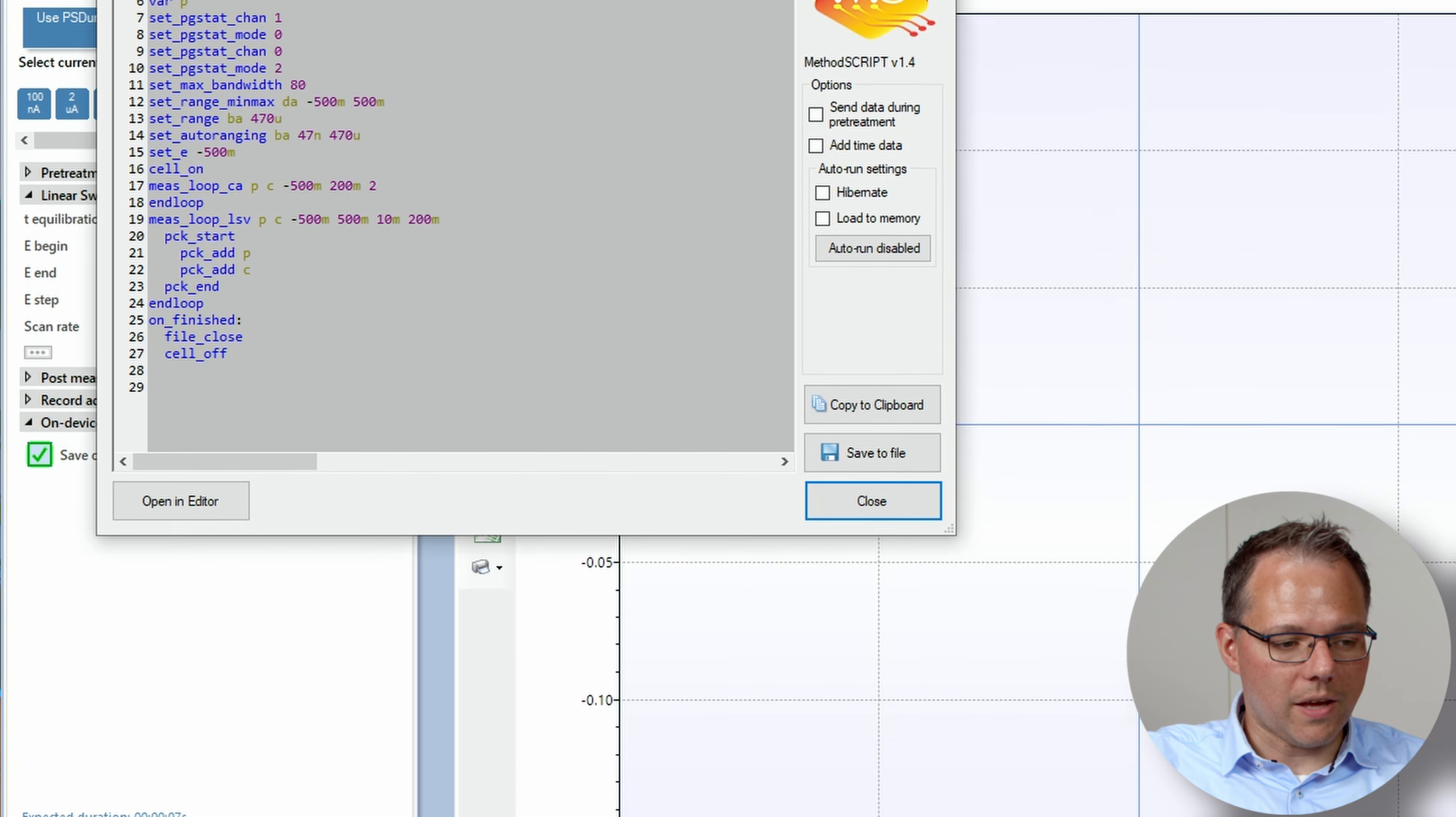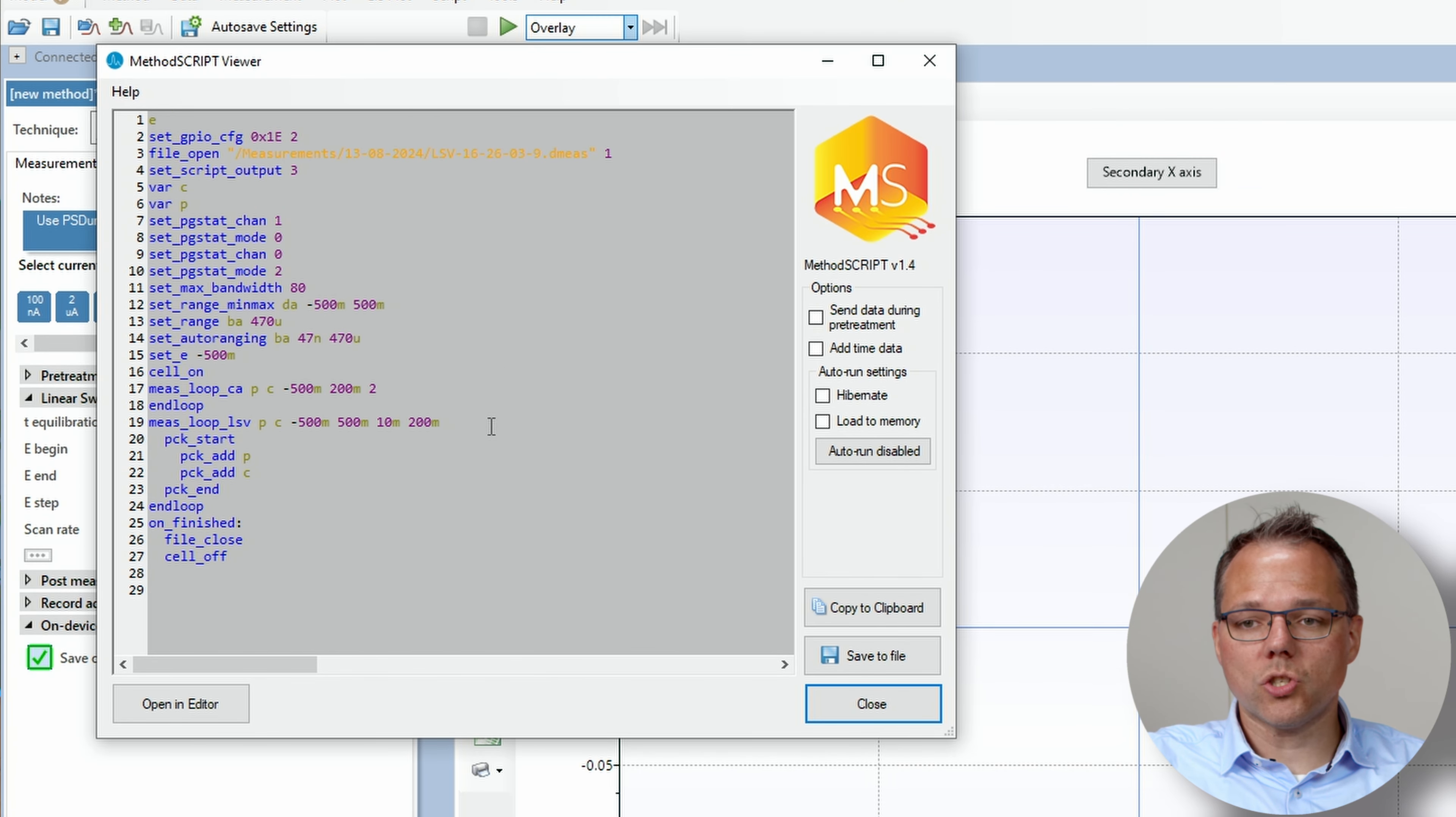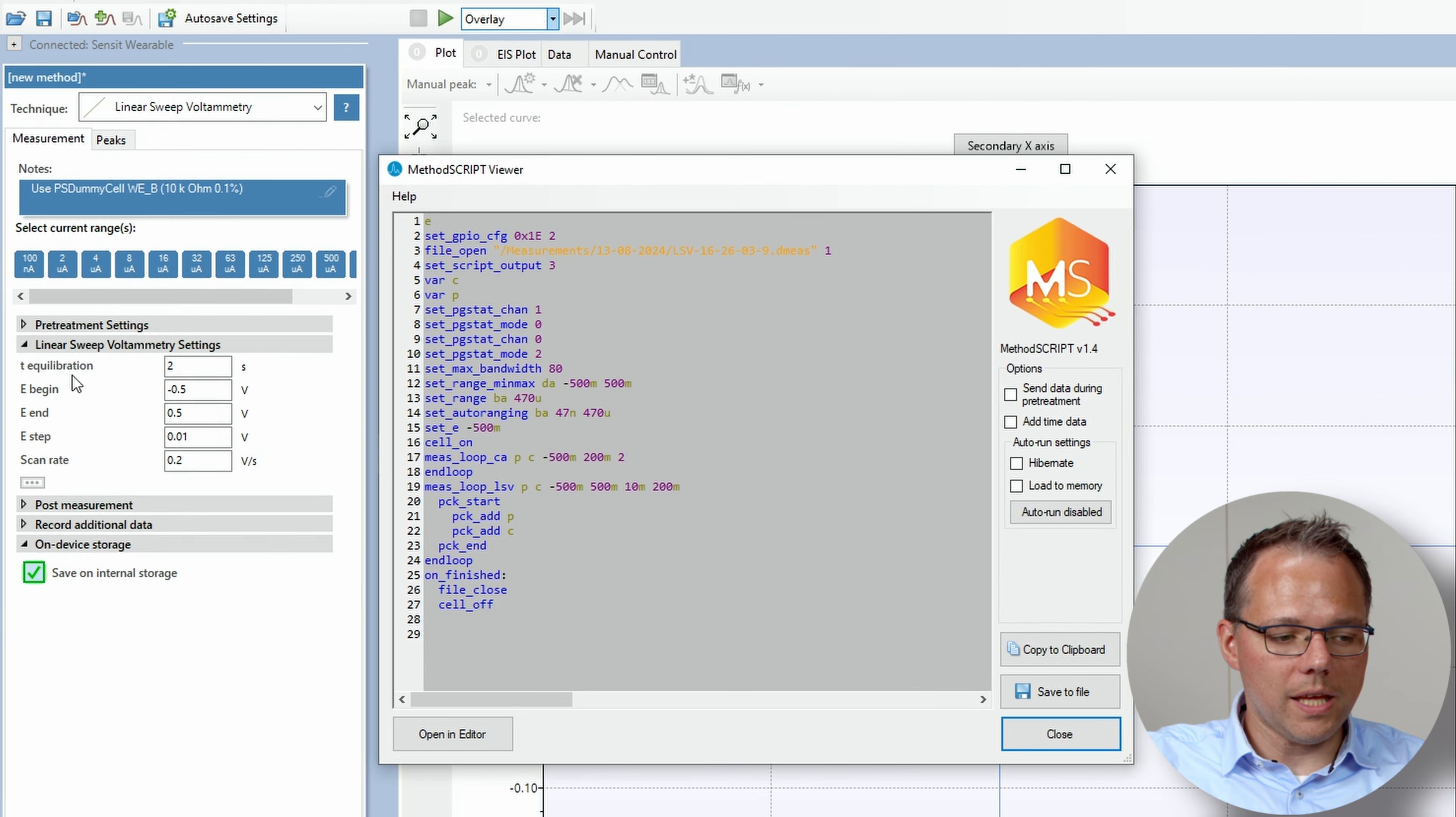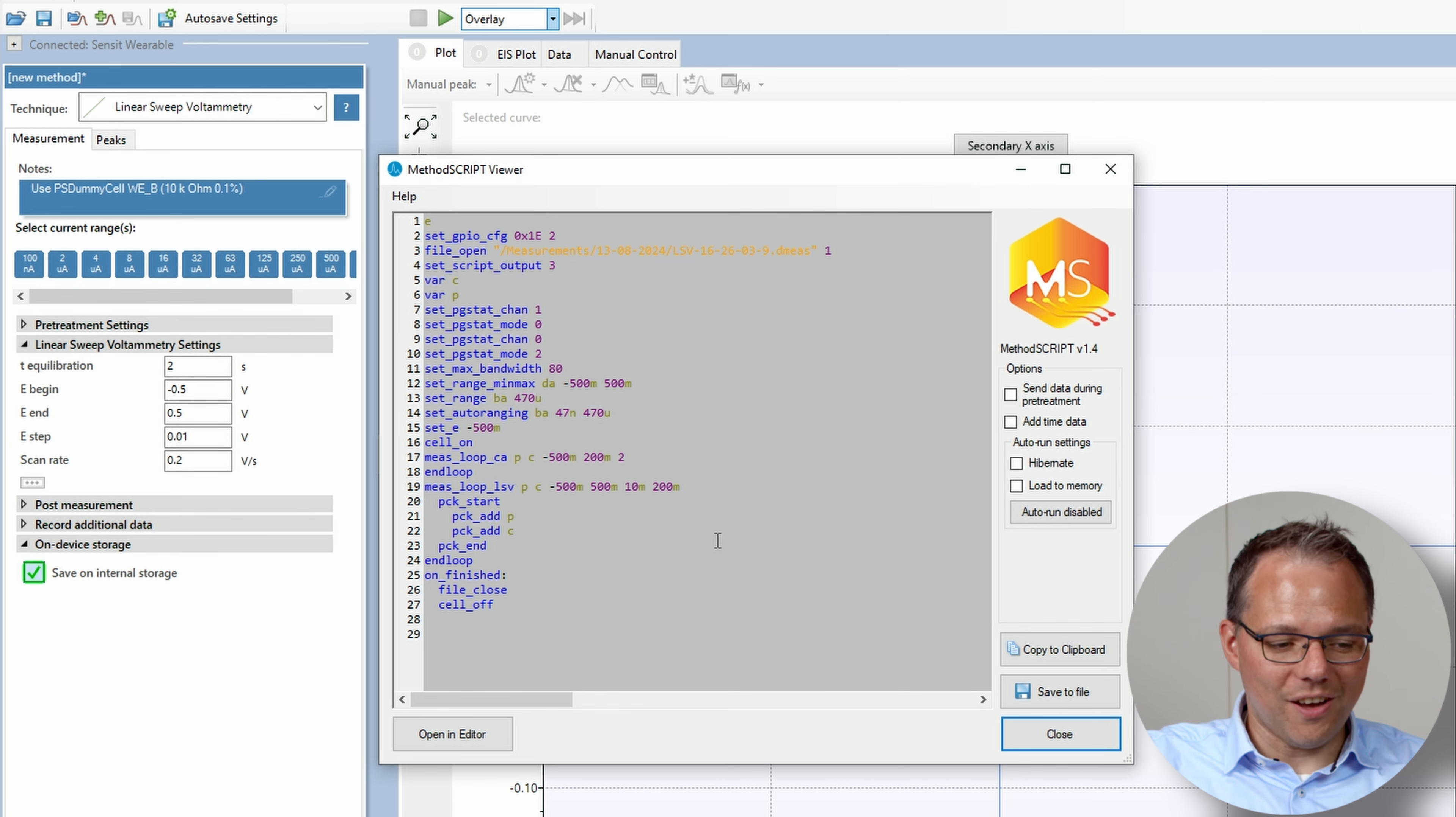Okay first I go to the menu and let me show how the method script looks like for the parameters that I've chosen here. So this is the method script that I've chosen.